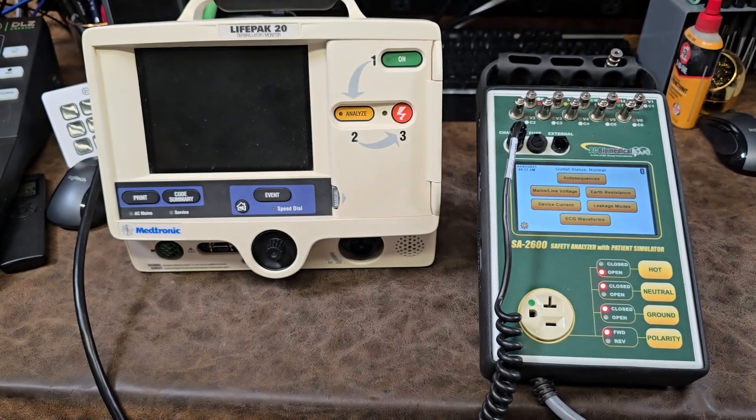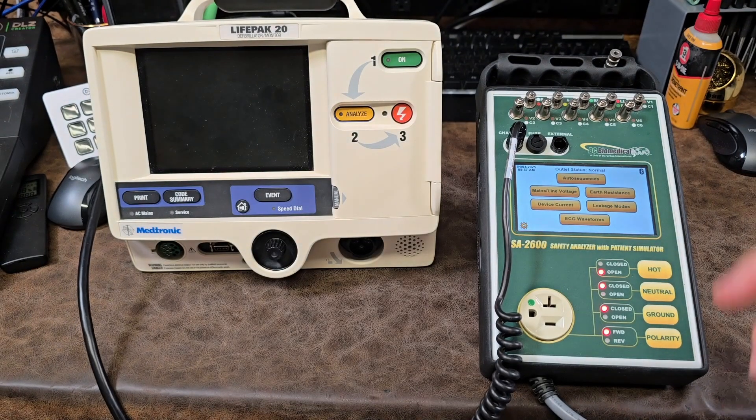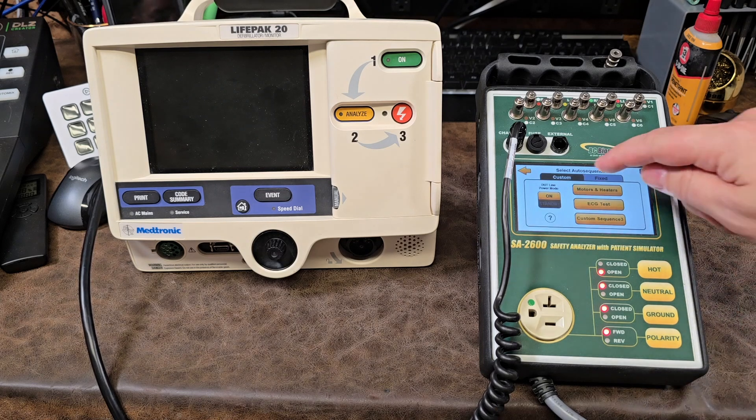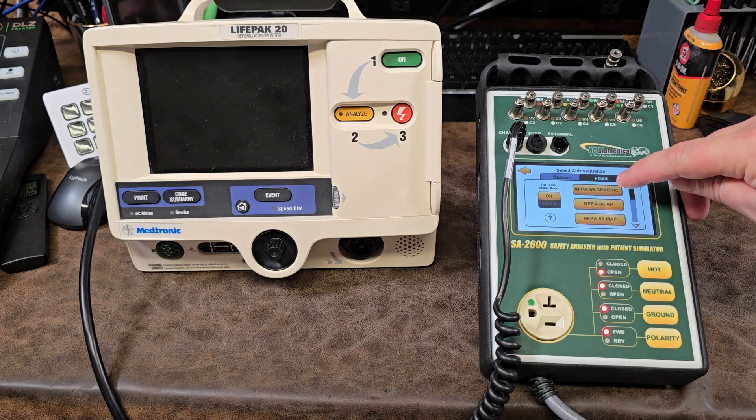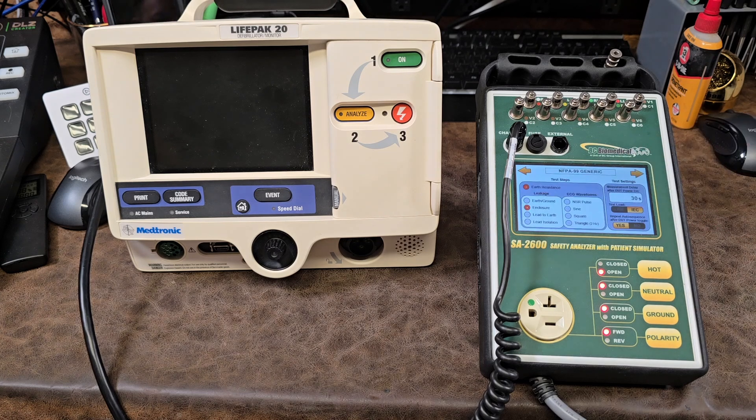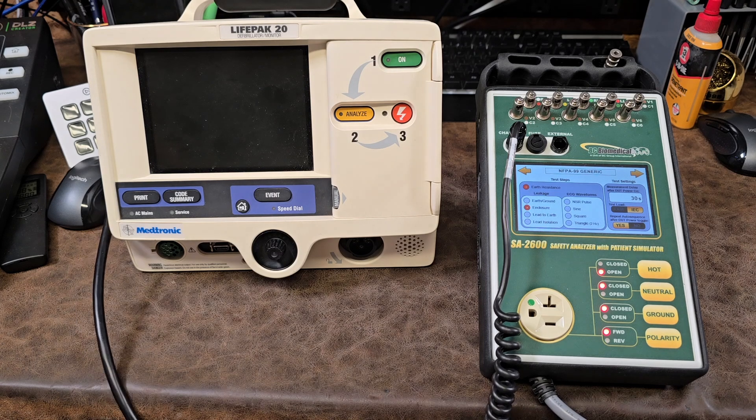Let's go ahead and lay that cable over there. The first step in the auto sequence is to press the button — we have custom or fixed. Let's go to fixed. You can see one of the options right here says NFPA 99 generic. Let's go ahead and touch it.